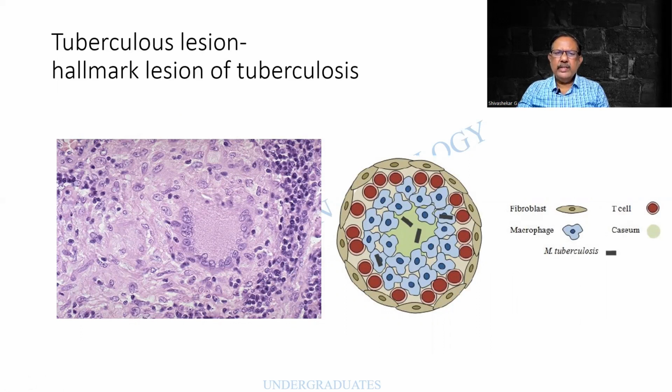What we are supposed to see is a granuloma. Granuloma means you find it is a small lesion, hardly about 1 millimeter in diameter. But then it is an aggregate of these cells. Look at these, these are the nuclei. They are all slightly bent, bean-shaped nuclei. They are quite pale. But still paler is the cytoplasm. Look at the abundant cytoplasm that I am seeing over here. And this will be the necklace pattern of distribution of the nuclei.